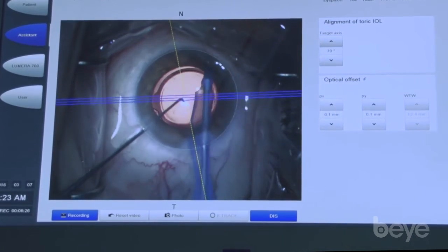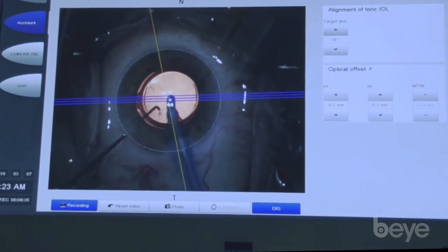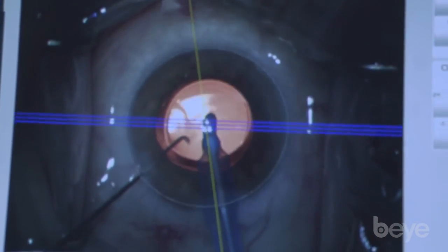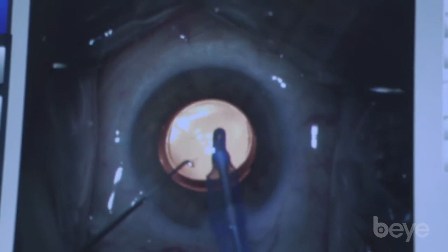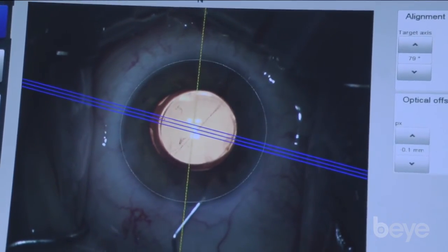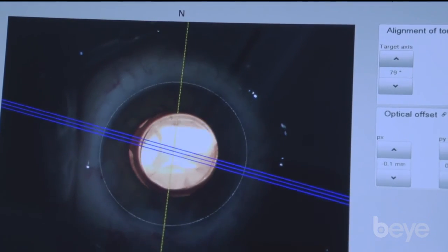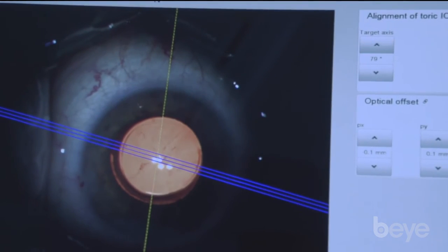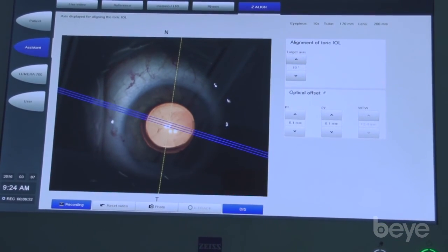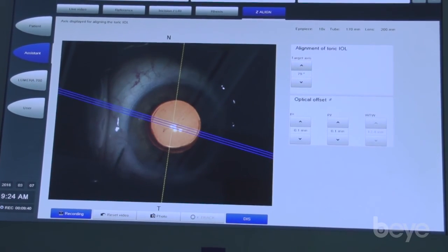A lot less thinking goes into this — it's not necessarily a new skill to integrate all of this technology. This was a markerless registration. You can see some faint marks I placed in the event that we somehow lost registration — those were placed with the RoboMarker and infrared. A little trick: because you have coaxial light, I'll turn down one of the lights and ask the patient to look at the upper or lower light. Because our hash mark is toward the upper light, I'll ask her to look at the upper light — and you can see her line of sight is perfect. Spot on. So are my toric markers.